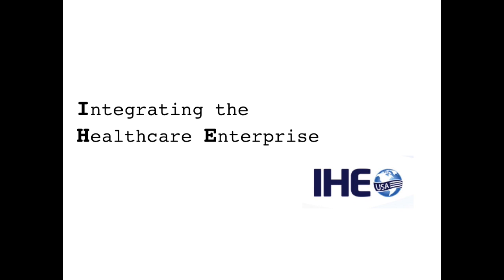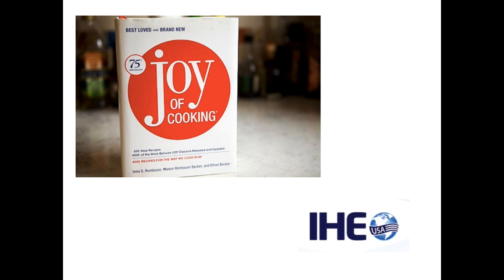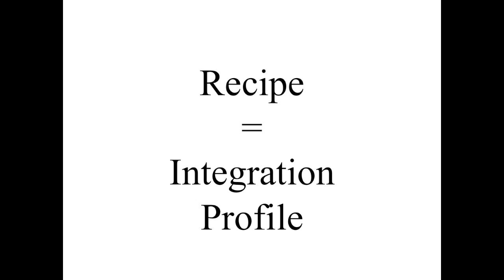Now that we've gone through the end-to-end workflow for the radiology department, I wanted to talk briefly about IHE, or Integrating the Healthcare Enterprise. DICOM and HL7, more HL7 than DICOM, are fairly loosely organized standards. And so what IHE aims to do is to put together existing standards into so-called recipes or guidelines. Those recipes specify how to use the standards in the best possible way so that things can be more consistent across enterprises and across multiple vendors. A recipe is called an integration profile in IHE parlance. So that's what you'll hear people talk about: integration profiles.